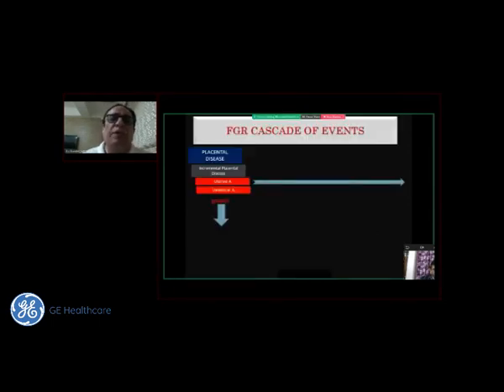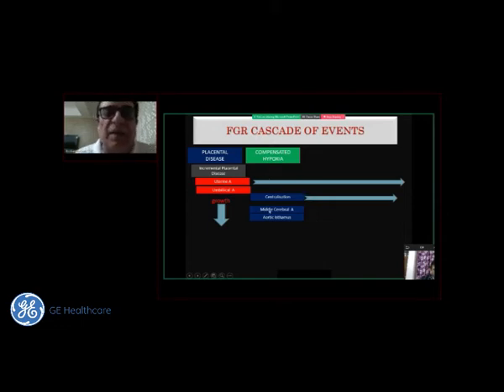Subsequently, we produced a lot of papers, but you can see the cascade of events as Doppler shows us the pathology when FGR progresses. As the placental disease increases, you will have increased resistance in the uterine artery and in the umbilical artery, as we spoke about, the perfusion defect in the placenta, and this causes a growth deficit. And then the fetus centralizes, the fetus pushes blood to the head via the middle cerebral artery, via the aortic isthmus, and this is called the compensated stage of hypoxia.